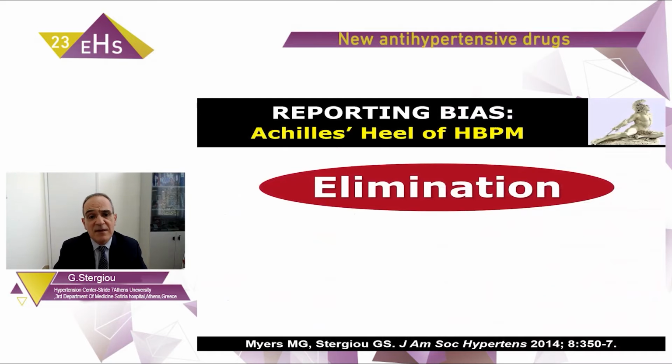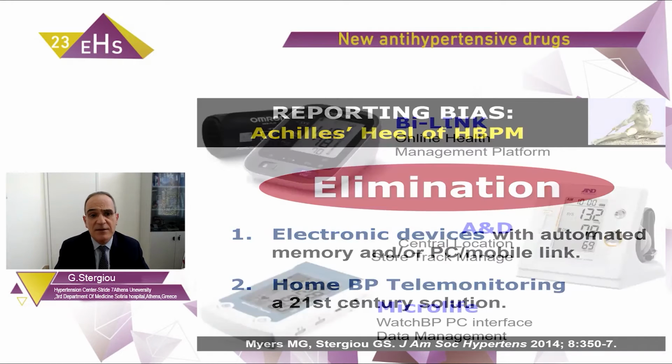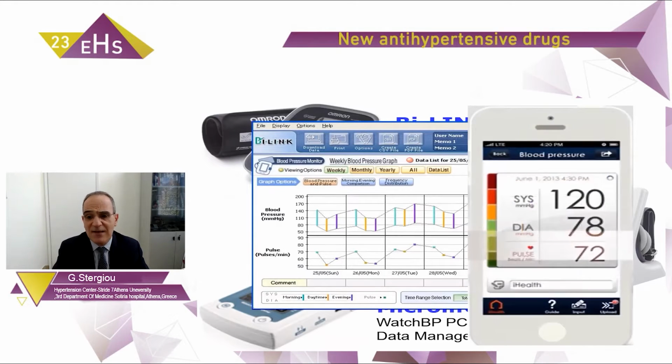But there is an ability to eliminate this bias with modern technology. Electronic devices with automated memory and PC or mobile link can give an objective picture of the blood pressure level at home. And home blood pressure telemonitoring is a 21st century solution for hypertension. There are several low-cost devices with the ability to connect with your mobile to provide graphs and averages of long-term home blood pressure monitoring and put all this data instantly in your mobile, in your pocket.